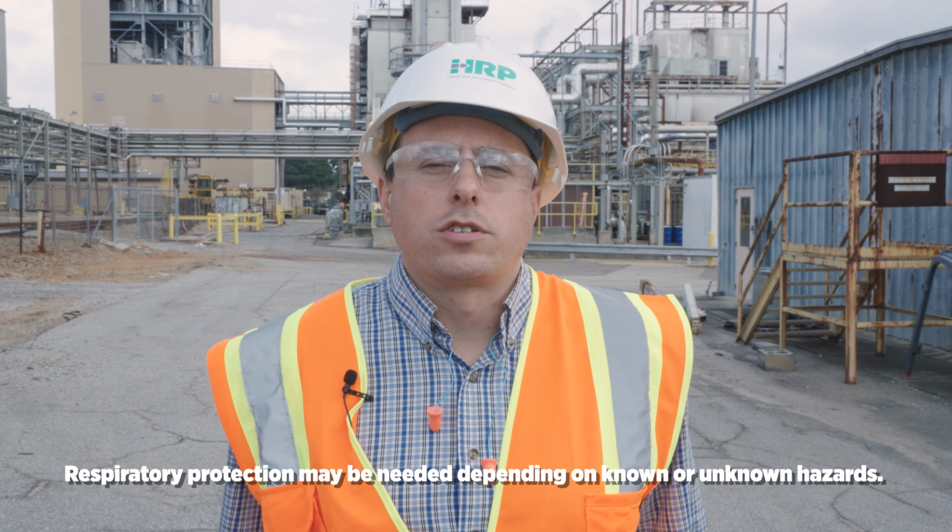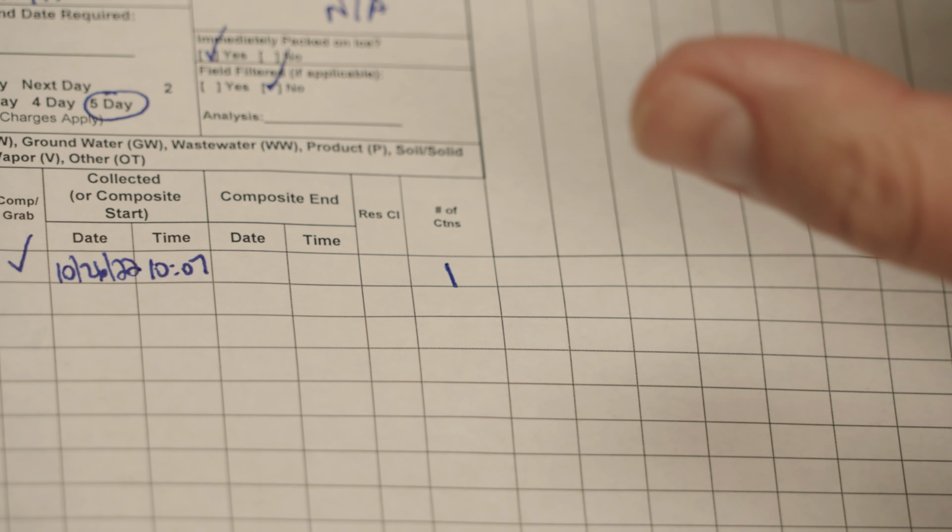It was a grab sample, so we'll check that box. The date that the sample was taken, so we'll put today's date. The time the sample was taken, so it was taken at 10:07 in the morning. And it wasn't a composite, so we're not going to fill out these boxes here. There's the one sample bottle, so we're going to put one there.